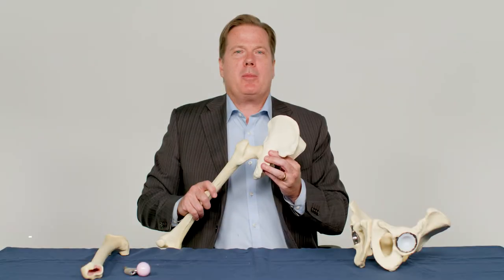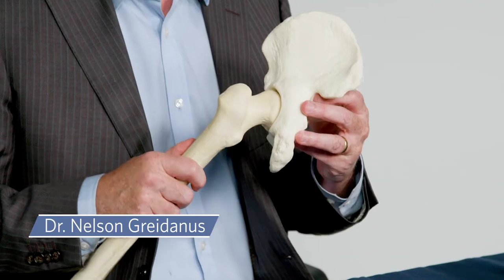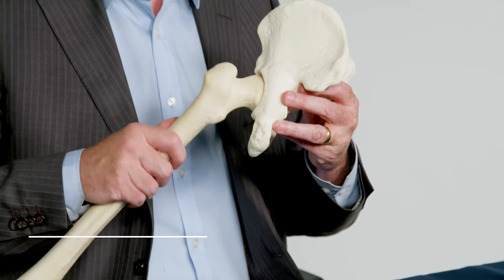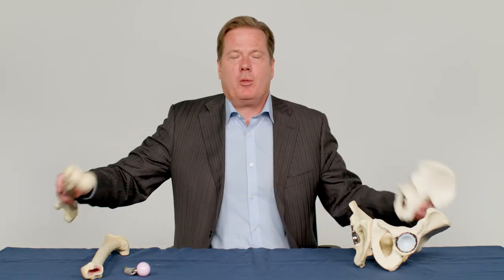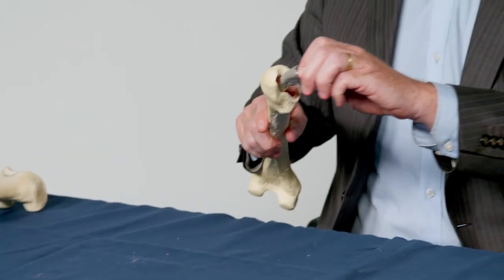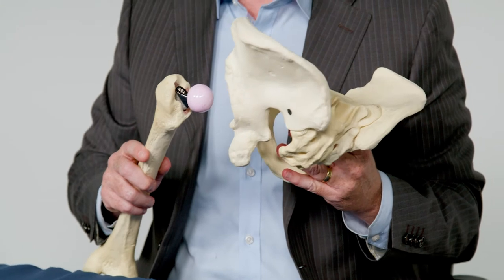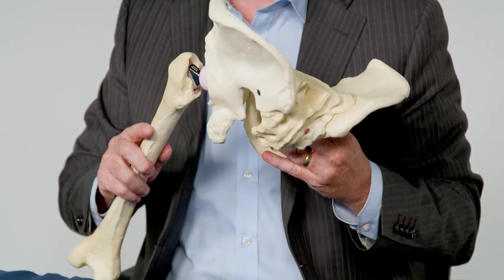Hip replacement surgery may be performed when arthritis causes the cartilage of the hip joint to wear away, making it stiff and painful. With a standard hip replacement, both the ball and the socket of the hip are replaced with artificial materials, allowing the return of normal movement.